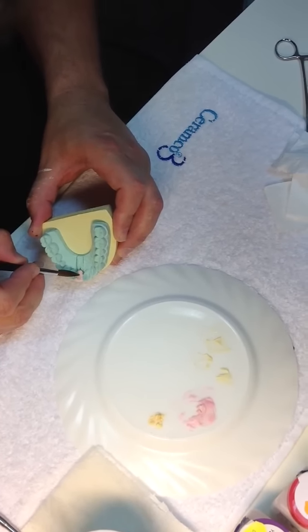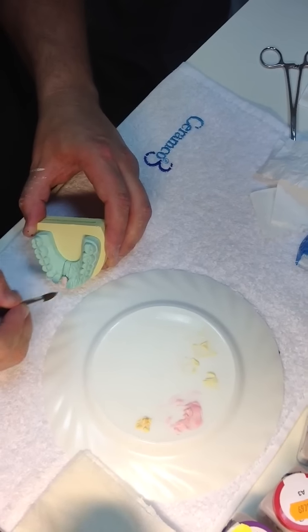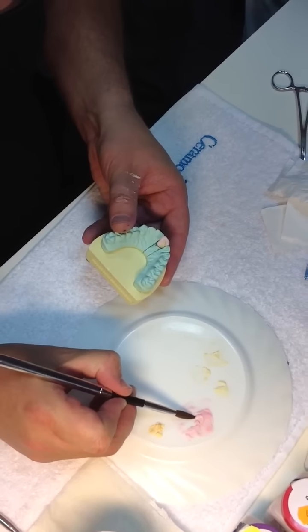I'm just going to use dentine just to complete the palatal profile, just to close all the space on the palatal side.